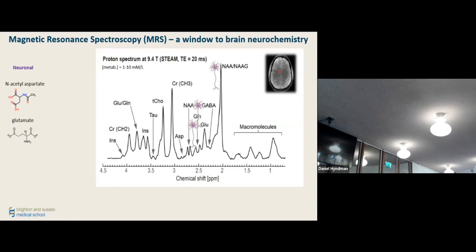Glutamate, you do know, it's the major excitatory neurotransmitter in the brain, and it does have also quite a few resonances. This is the chemical representation. We have a CH2 group here, we have a CH2 group here, we have a hydrogen here, and we have all sorts of labile protons that are not considered to be contributing to the signals. And you can see that glutamate, for example, contributes here, glutamate contributes here. And also this shoulder level, so contribution of the glutamate signal.